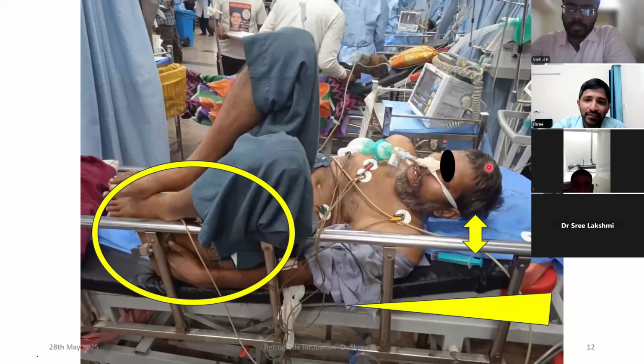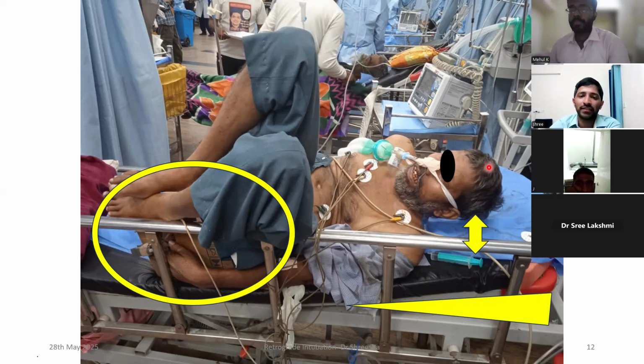However, if your airway is sort of secure for the moment, there is no active aspiration, you are able to adequately ventilate the patient and you are able to adequately oxygenate the patient, in this particular scenario, wherein you have at least 2 to 3 minutes before you secure a definitive airway, this will be the best subset of patients wherein you can go ahead with the procedure, so that it's sort of less invasive as compared to a surgical airway. And please do not perform this in cannot ventilate and cannot oxygenate situations.